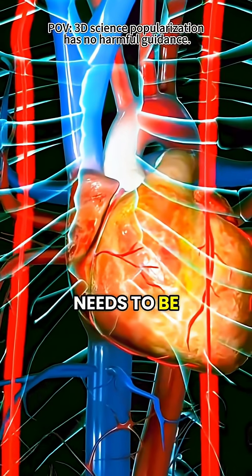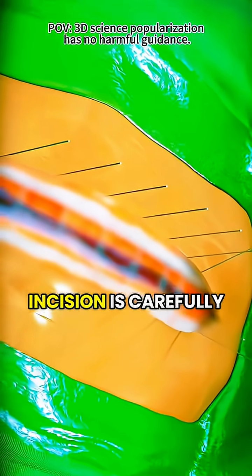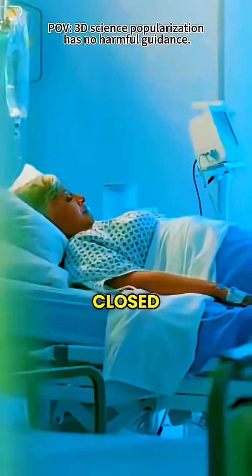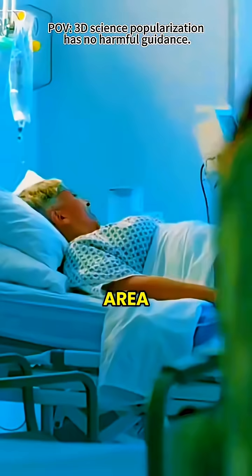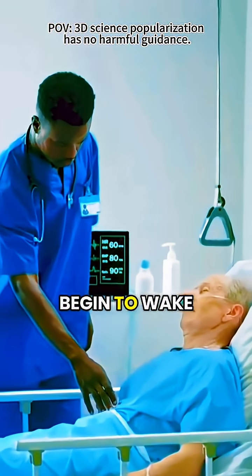Once everything that needs to be done is completed, the breastbone is brought back together and the incision is carefully closed. After that, the patient is moved to a recovery area where doctors and nurses closely monitor them as they begin to wake up.